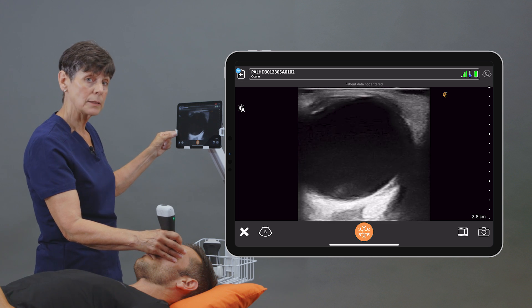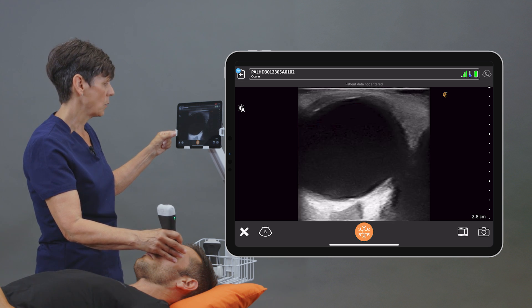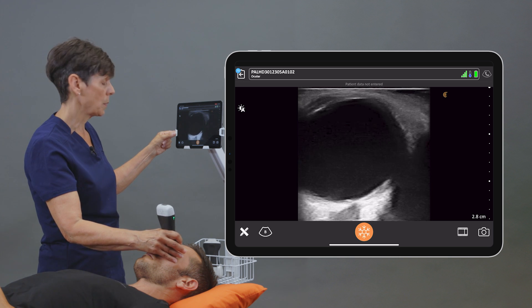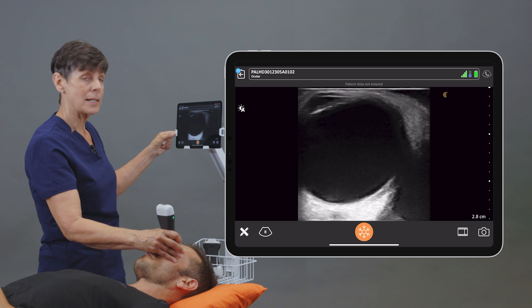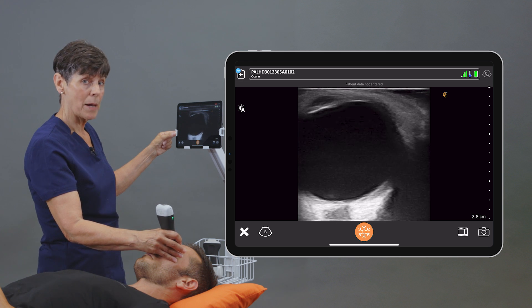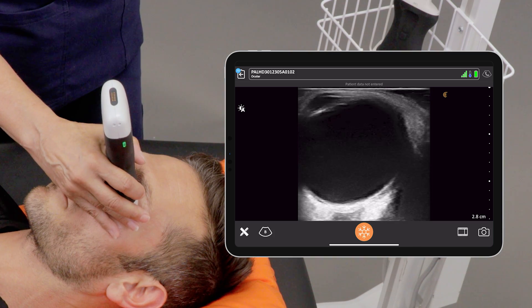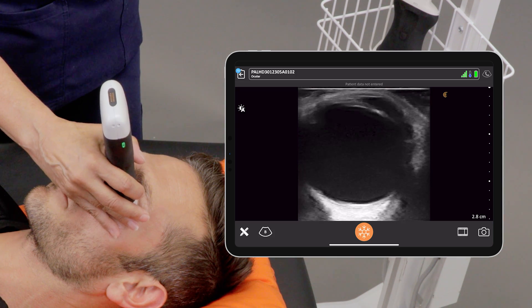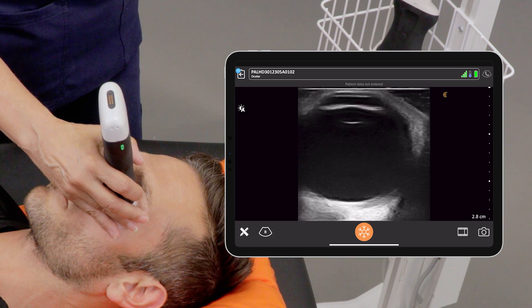Now if I was looking for a retinal detachment, I would see free-floating retina on one or both sides of that optic nerve, keeping in mind that it's tethered to the optic nerve. And in cases of vitreous hemorrhage, you may see a membrane or echogenic debris floating around within the vitreous body. Especially if the patient moves his eye back and forth, that would help demonstrate those loose bodies or echogenic debris.